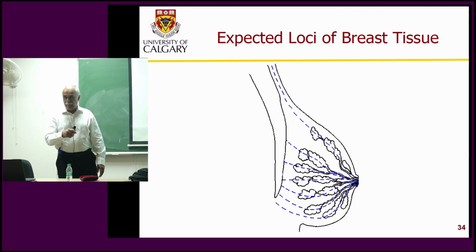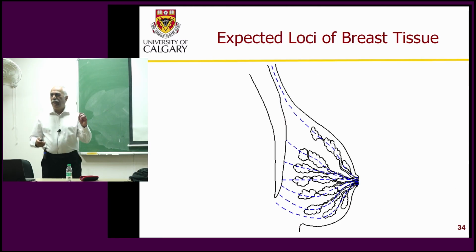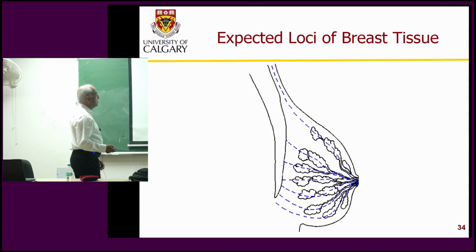So to draw these lines, we need some reference points, landmarking. I talked about landmarking of CT images, where we encountered ribs, spinal canal, hips, and so on, hip bones or the pelvic bone. In a mammogram, if it is an MLO, medial lateral oblique view, there will be the pectoral muscle.